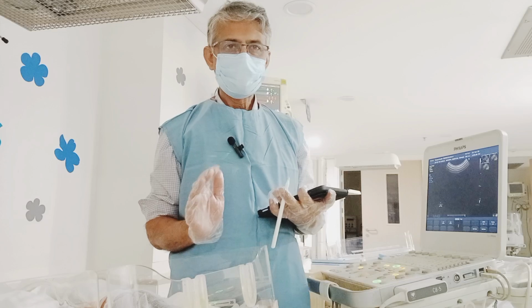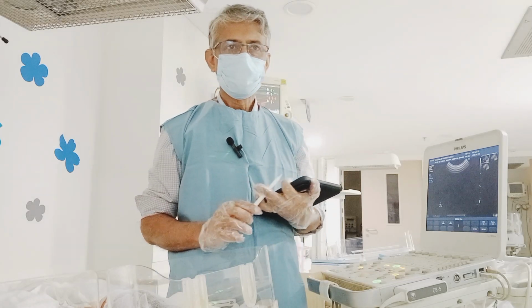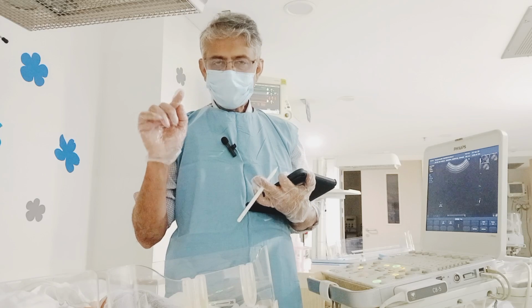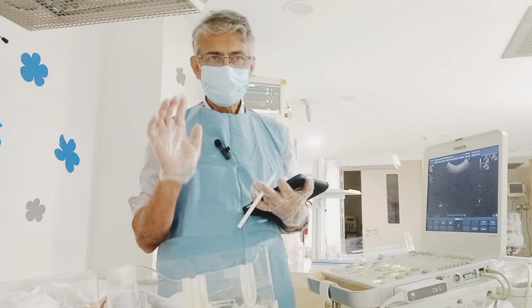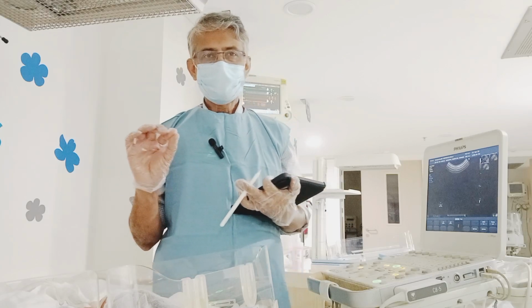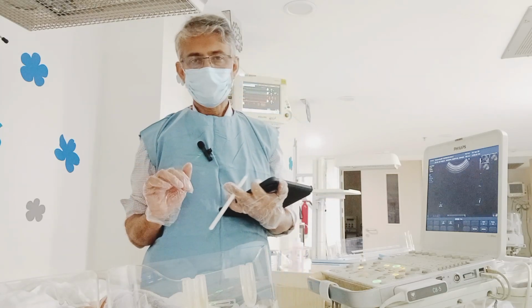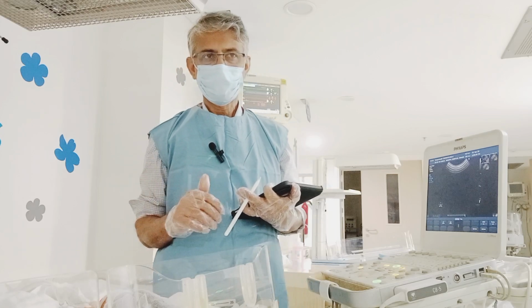The lumbar puncture is done routinely in the newborn intensive care unit to rule out meningitis, and usually the needle is inserted. The needle we use, irrespective of gestation age, is the same needle, and we don't know the depth of the needle. We just go with the giveaway sensation and see that the spinal fluid will come. But most of the time, failures or traumatic samples will happen.